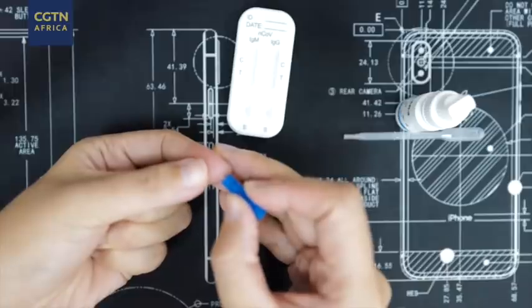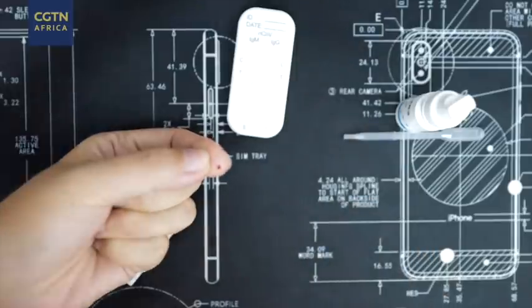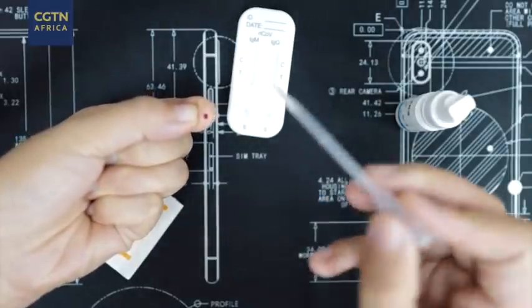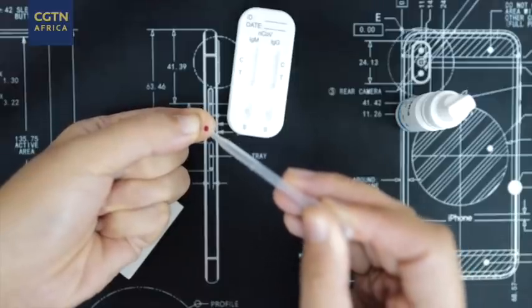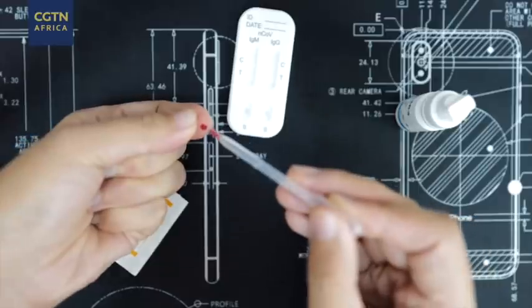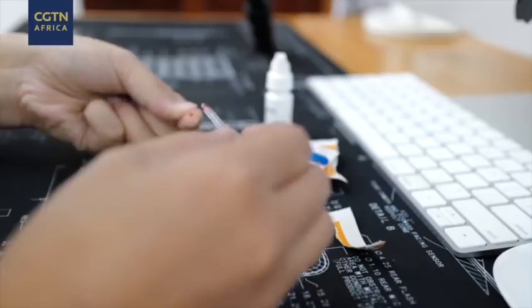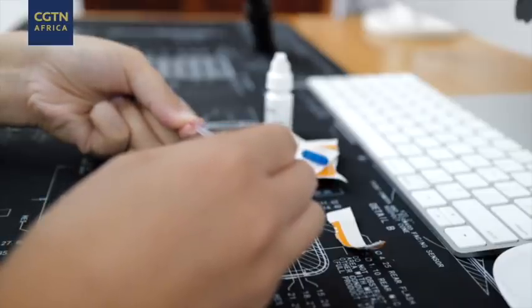One, two, three. Ouch. This is the straw. We're going to use this to transfer the blood. I think I need more blood to drop there.